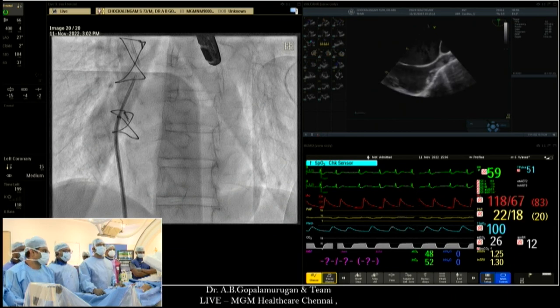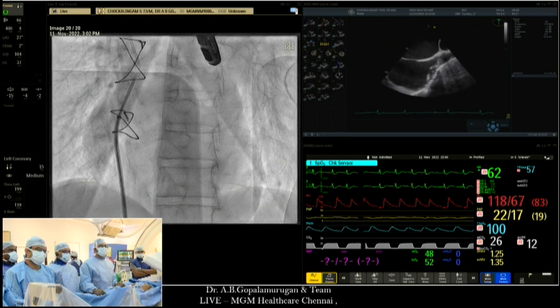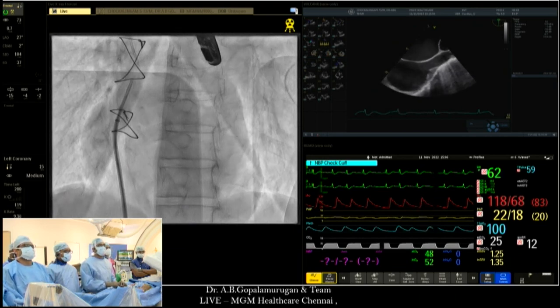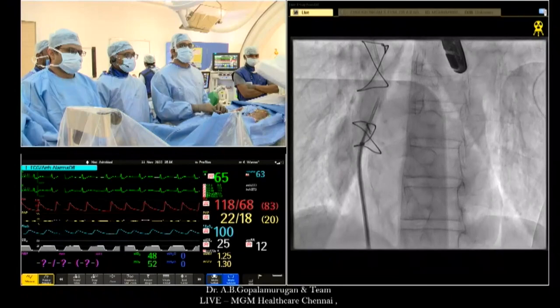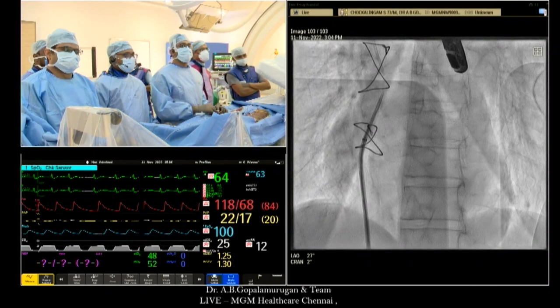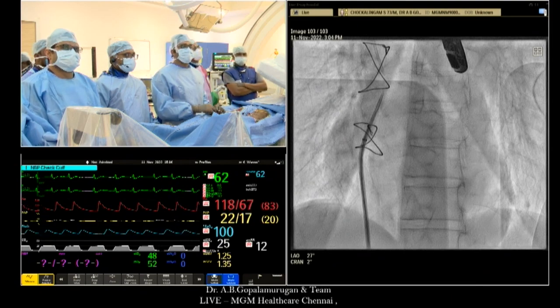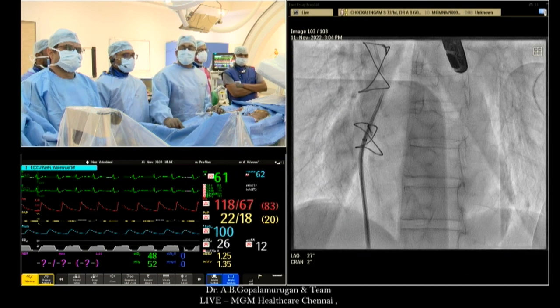So, Gopi, what was the area of the LVOT? Go ahead and show us the transseptal. Transseptal we have not done. We're just in the process of doing the transseptal, so we're going to get on with it while you keep discussing. You can see the images. We're trying to get a very posterior and low transseptal to get a good trajectory. I'm going to show you the views. Can you show the views, Sini?